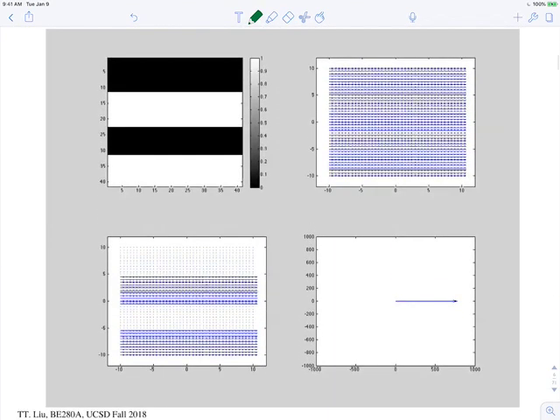Okay. So we'll review the demo that Professor McVeigh did last time. Let's make this up: this has density 0, 1, 0, and 1. That's my object, a very simple object. What you're going to see here is the phasor pattern, and we're going to see how it moves. Right now you can't really see it, but all the arrows are pointing in the same direction. As the movie goes on, you'll be able to see things more. This is now the phasor pattern multiplied by my object.